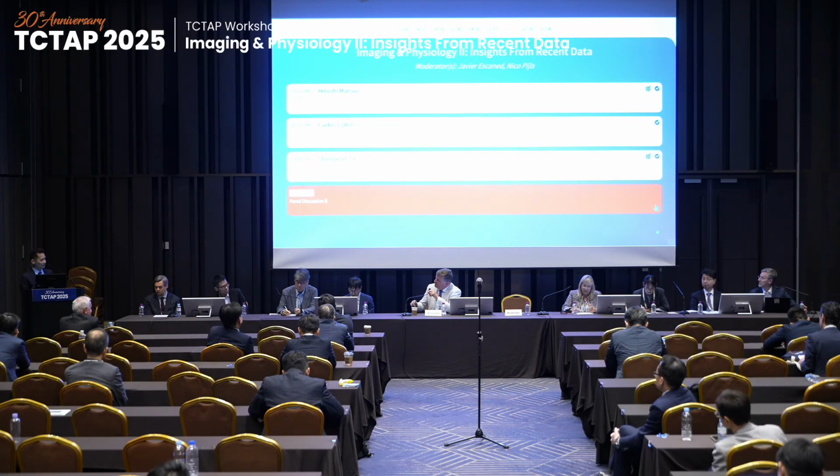And second, I think for CT scanning, the quality is still variable among centers. Maybe in the future, photon counting CT will change this game. But at this moment, angio still has a better resolution. And in some cases invasive angio would be better, if you have a better acquisition in angio. Yeah. And I presume that the computational methods have a lot of similarities.